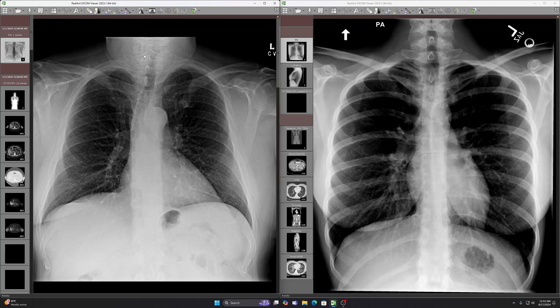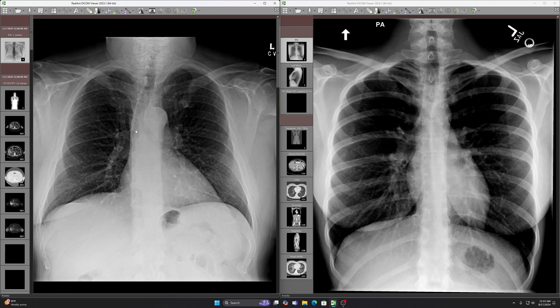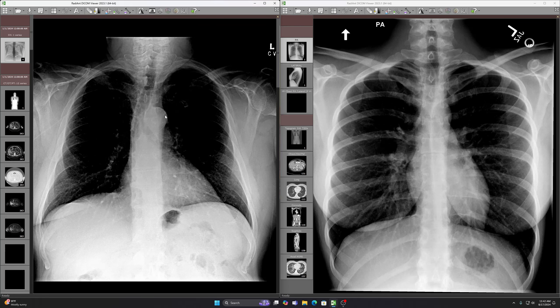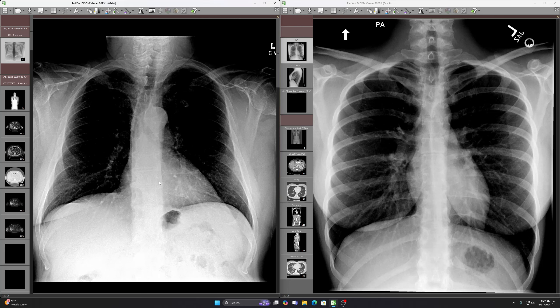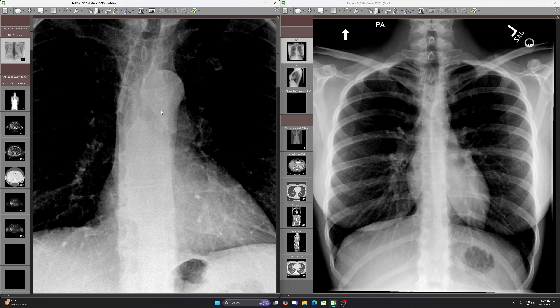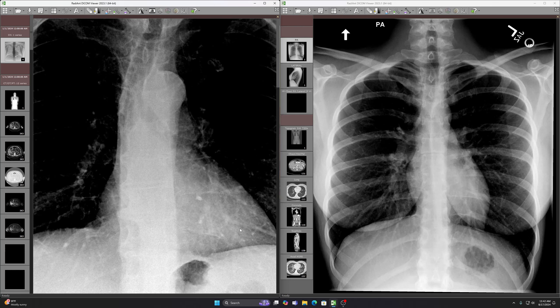If you haven't seen the abnormality yet, don't feel bad because this is a really tough case. I'll give you a hint: there's a normal line in the mediastinum that's displaced because of the abnormality. Have you seen it yet? The abnormality is right here.